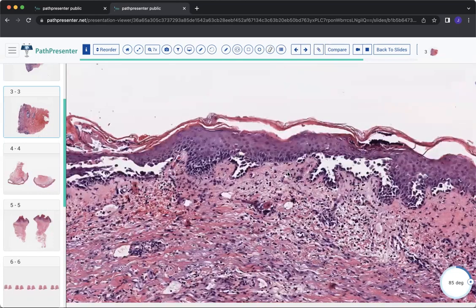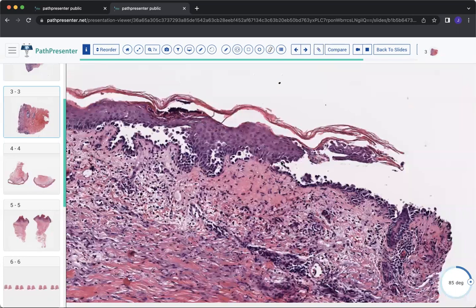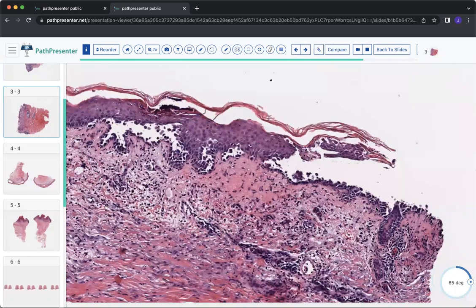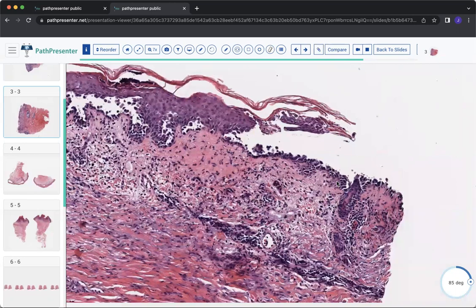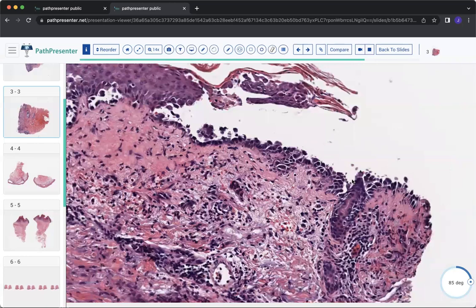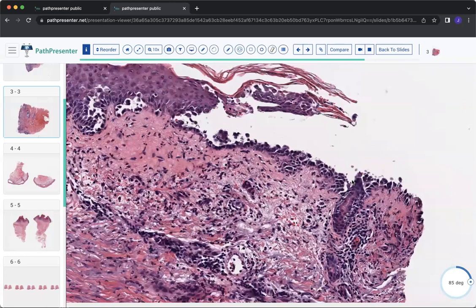So if they put pemphigus vulgaris and Hailey-Hailey on the differential, or both on the answer choice, it would be pretty difficult unless they told you that there was a direct immunofluorescence done and it was negative. So Hailey-Hailey is not an autoimmune bullous disease. It's actually due to a defect in the calcium transporter. So the DIF should be negative, okay?